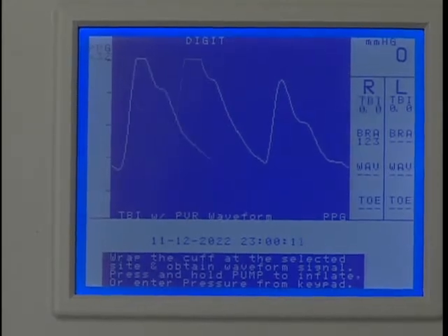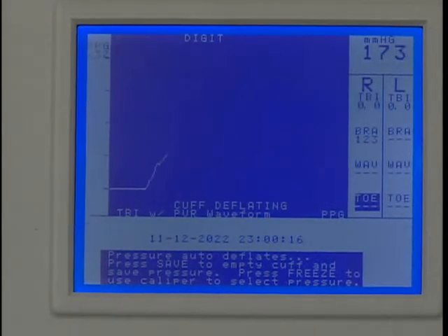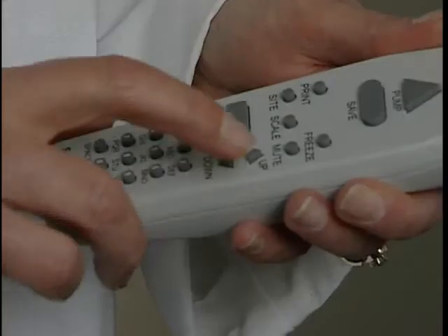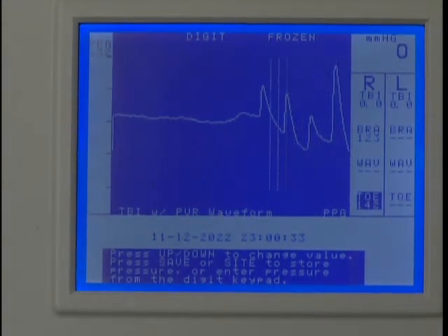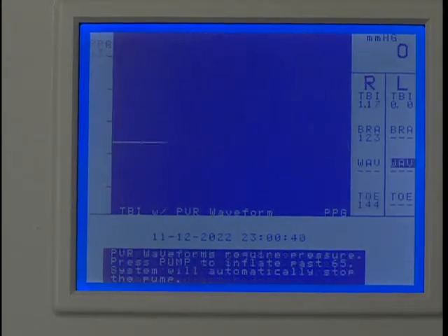Once an optimum waveform is viewable on the screen, press and hold Pump until the PPG pulsations disappear. Release the pump and the cuff will automatically start to deflate. Press Freeze after several pulses have reappeared. Press the up or down key to move the caliper tool to the beginning of the first upward slope at the start of the pulsation as shown. This is the systolic pressure. Press Save to record it and the marker will move to the next protocol location.